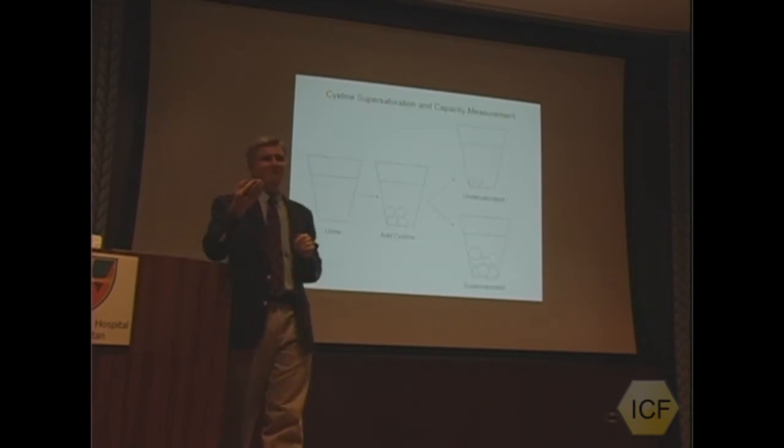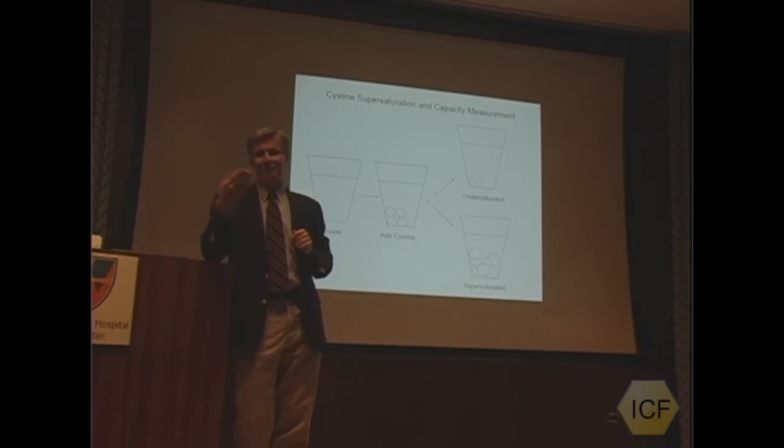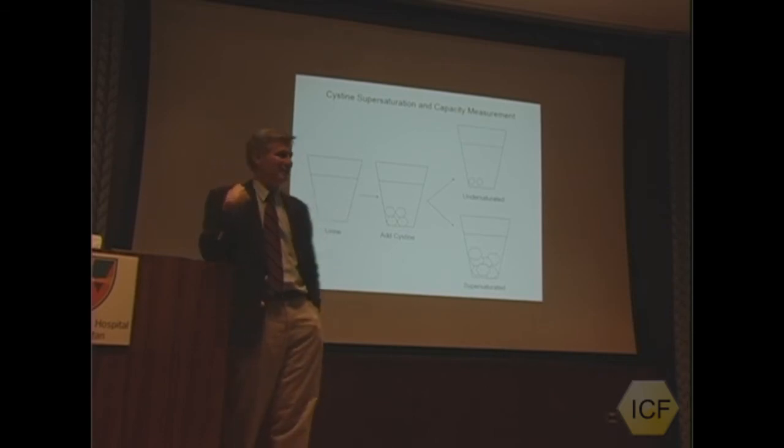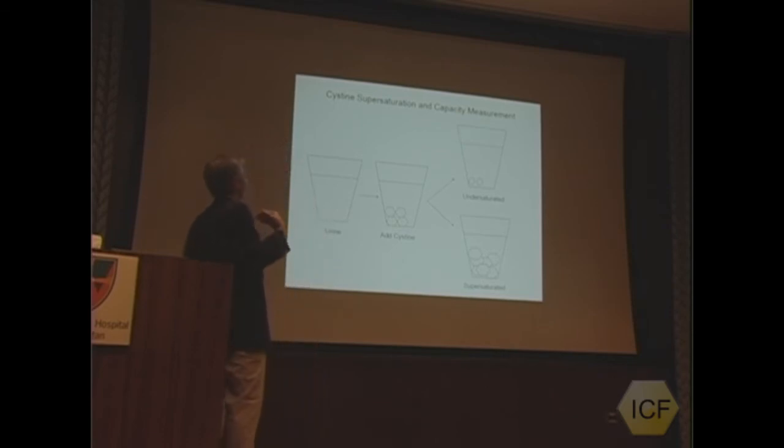So for all of you who sent in urine to Litholink, I appreciate it, and it's specifically for the study part of it that got us going, very appreciative that you bothered to take part. What do we do with all these urines, and what do we call cystine capacity and cystine supersaturation? You folks send us a urine, and we take the urine, not the one that's been alkalinized, but the one that came in, at its natural pH.